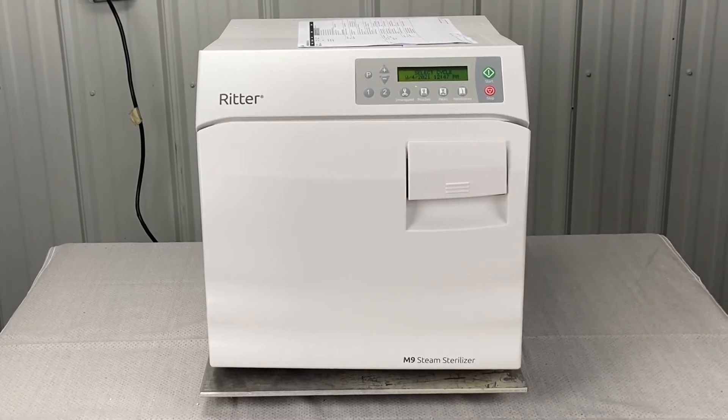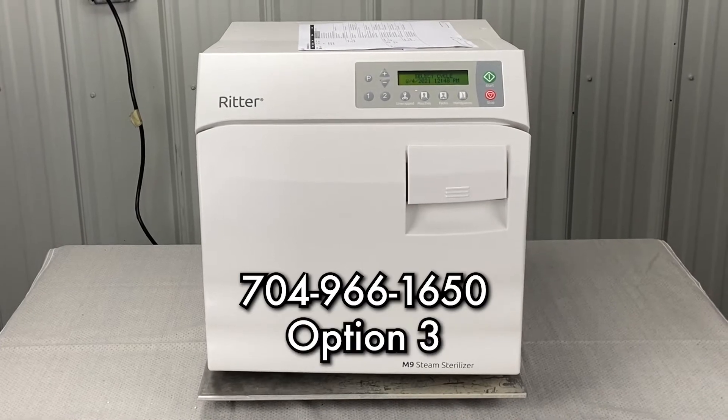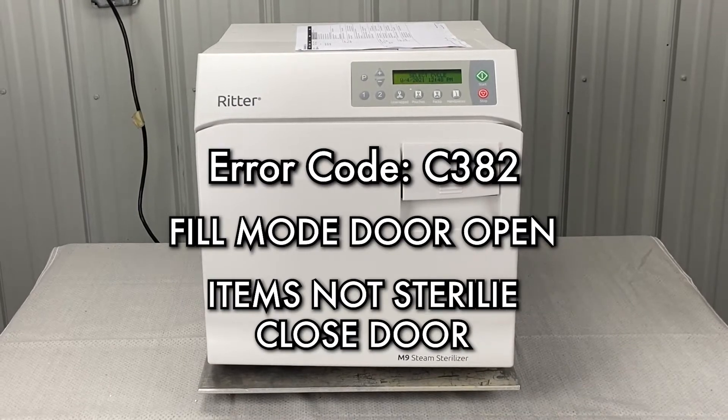Andrew here, Sterilizer Autoclave Solutions, 704-966-1650, Option 3, for free technical support. We'll talk about error code Charlie 382.